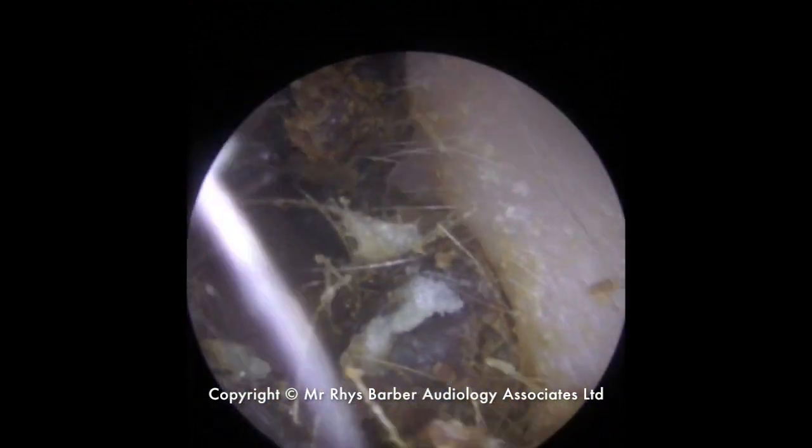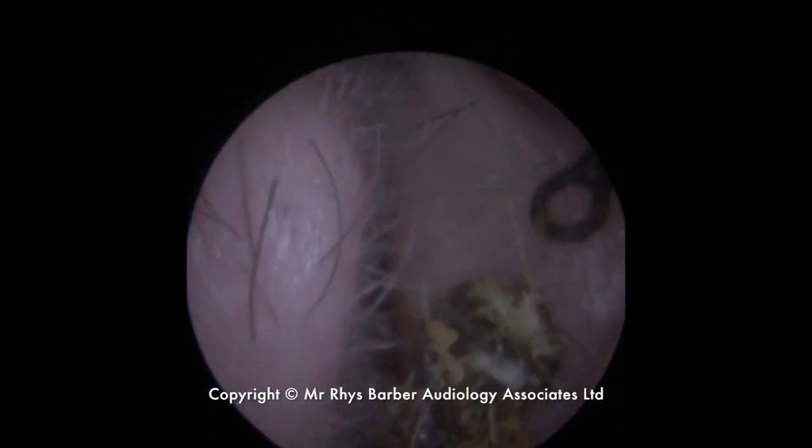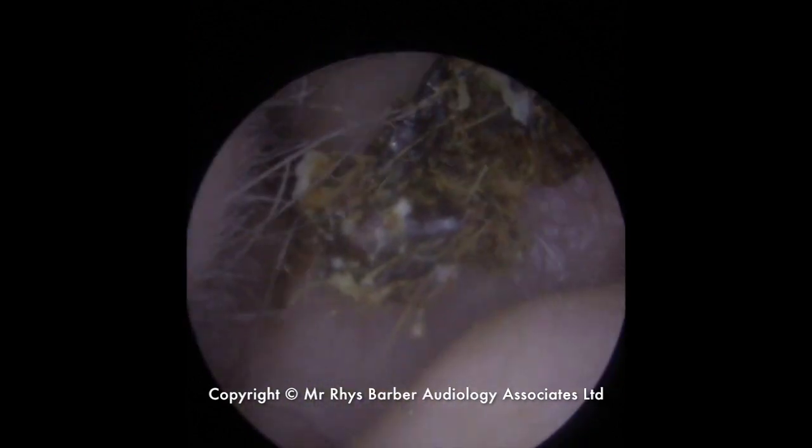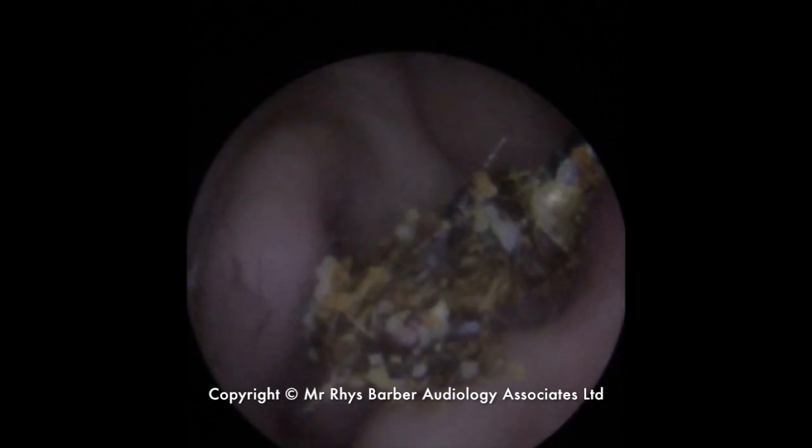This section of wax was really hard, it was really tough. I couldn't actually get the Jobson Horne into it to lift it up, so we had to use the suction end to pick it up. And there you can see it is there. So very old hard wax there.